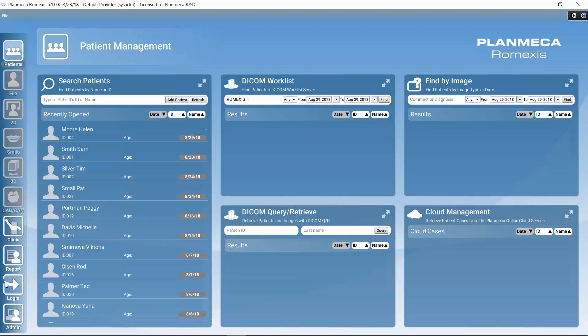Through the login, different users can log in to Romexis using personal credentials. We can define different user rights so users can work with Romexis as configured for them, and they also get their personal preferences upon logging in. In the admin module we can manage user groups and make various settings, which we will also look at shortly. First, let's see how to close Romexis after working with it.